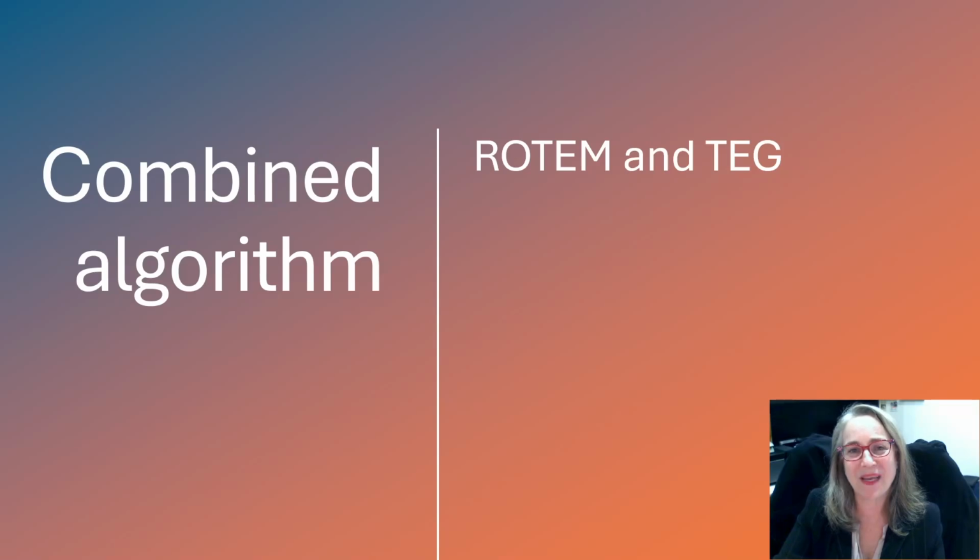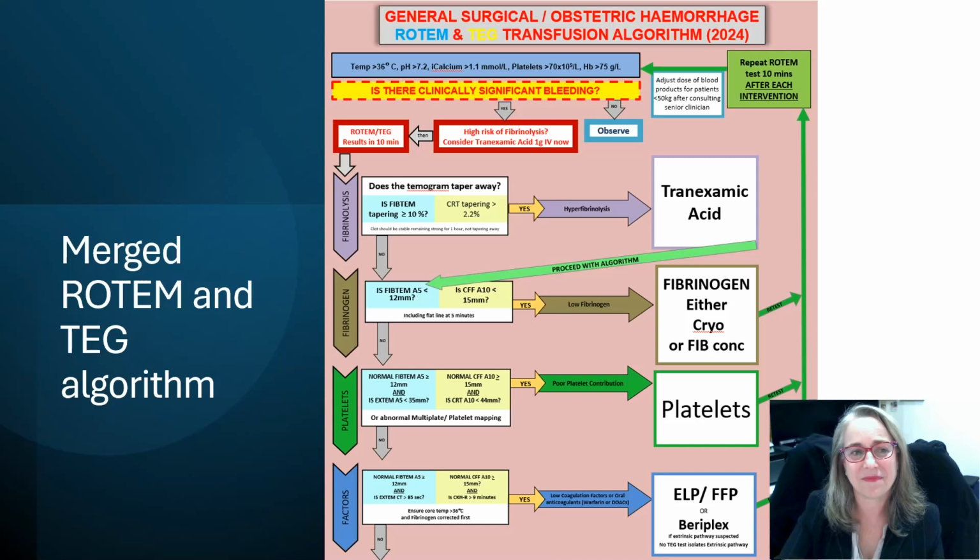I've spoken to a number of people from different hospitals, my colleagues, and we have created an algorithm that shares the two technologies so that you can learn them and understand them together. Even though they work a little bit differently, it's better to understand them together and understand the differences, I believe. So let's talk about Rotem and TEG and have a look at a combined algorithm.